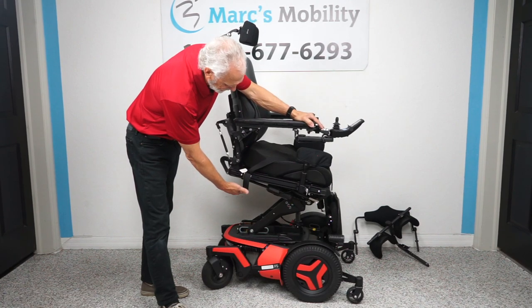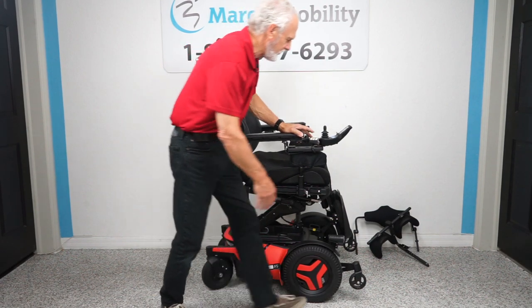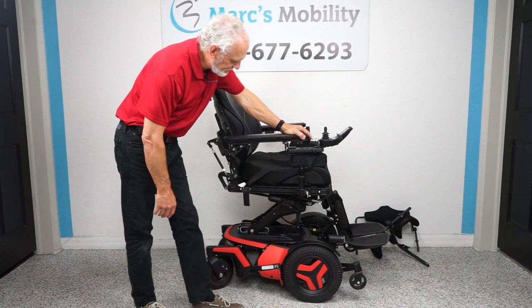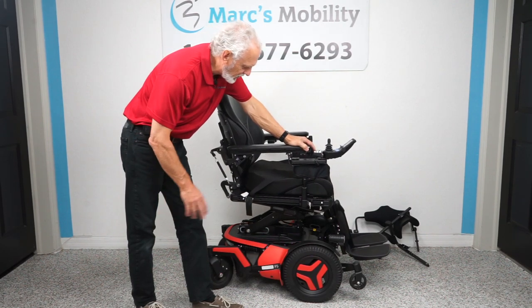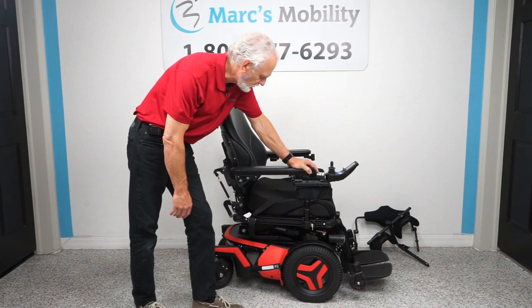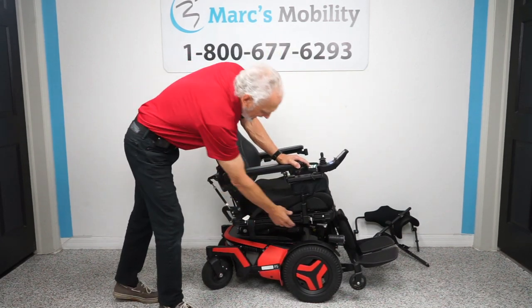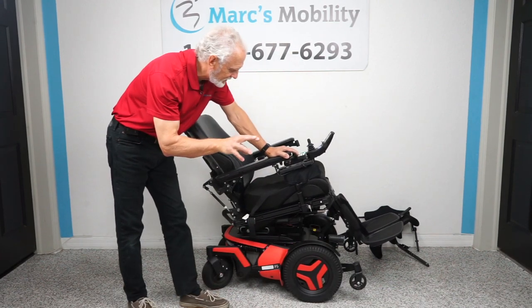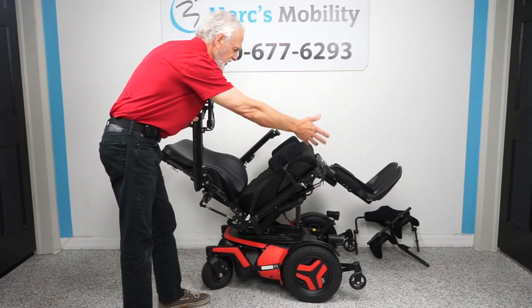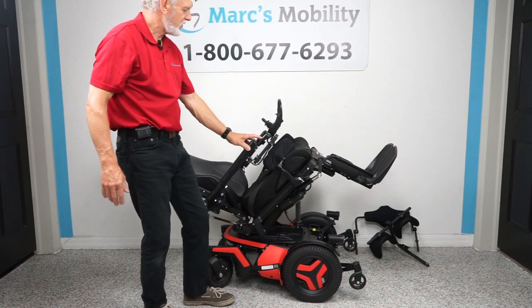We're going to bring the anterior tilt back down and put the foot plates back down. Now let's bring the seat all the way down and cover more features. We've done the standing, seat lift, and anterior tilt. Now we're going to do the electric tilt — tilting the seat base back. When the base goes back it takes the legs and back with it, since they're all connected. This is good for relieving pressure off your bottom and back, improving circulation in your legs — it has many medical benefits.